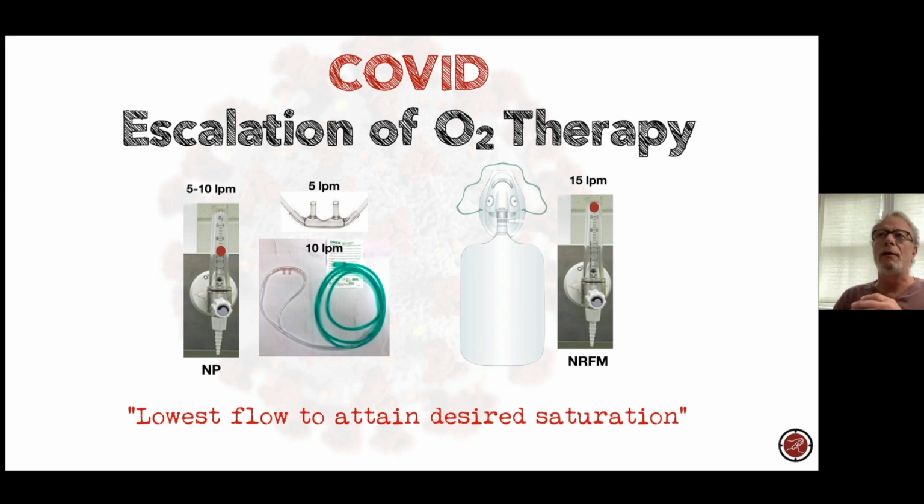What we do now is what we've really come full circle to. What I mean by that is that we're doing what the patient needs. If the patient needs oxygen at flows X, then that's what they should get. In every measure, these patients are always going to go, ideally, in a resuscitation area, ideally a negative pressure room, and you're going to be wearing appropriate PPE. And if you do that, then you don't have to worry about the details. Do what the patients need, give them what they need, and you'll be doing the right thing.